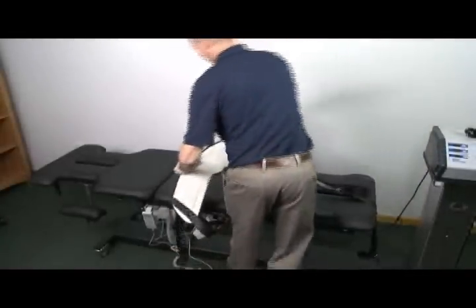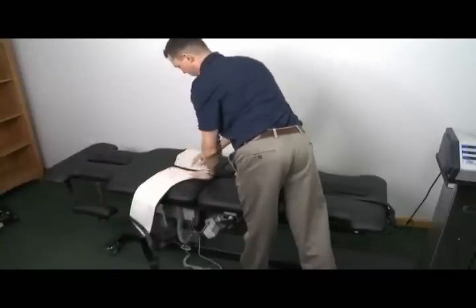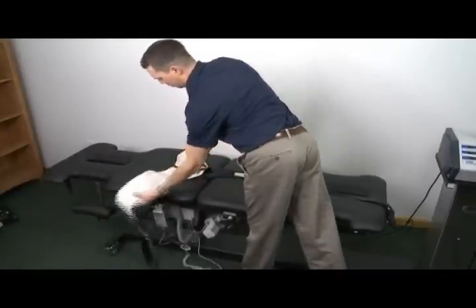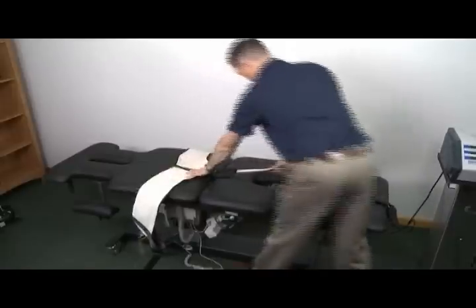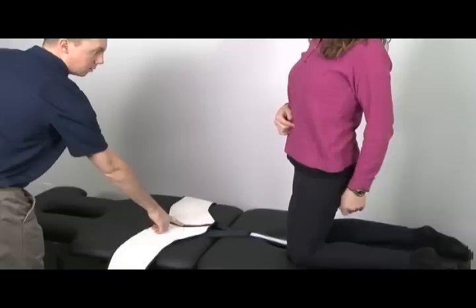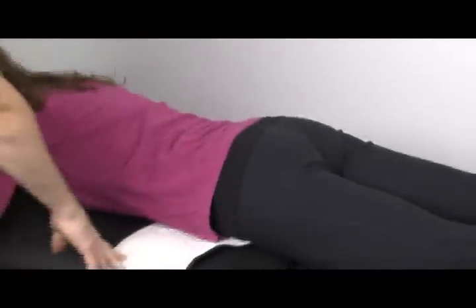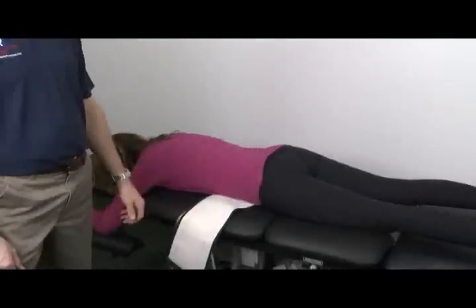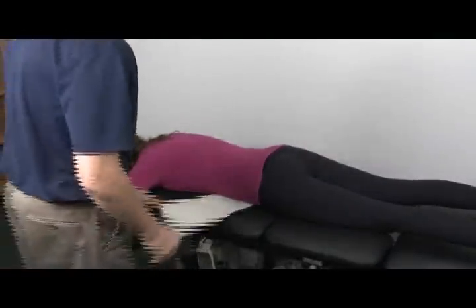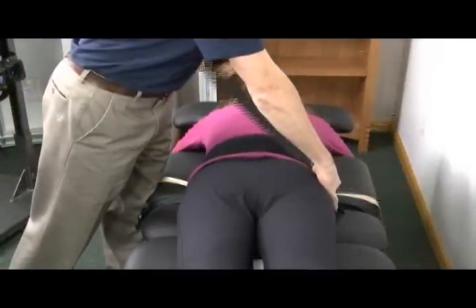For prone applications, place the belt as shown with the pelvic belt centered at the split of the table which separates the upper cushion from the lower movable section of the table. Have the patient kneel on the table and physically point to their belly button. Have them lay on the belt so that their navel is centered on the pelvic belt. Palpate to find the patient's iliac crest and ensure the center of the belt is at or slightly above the level of the iliac crest.